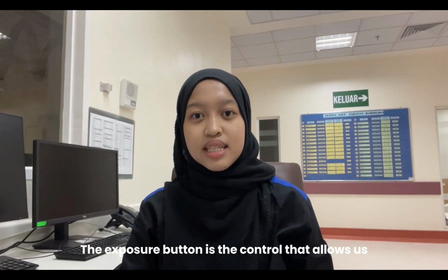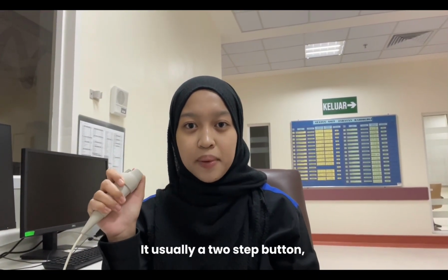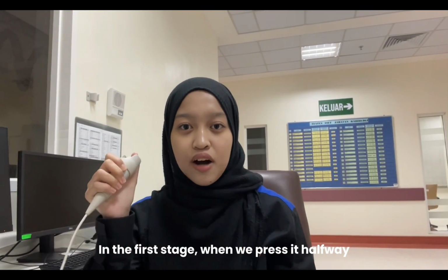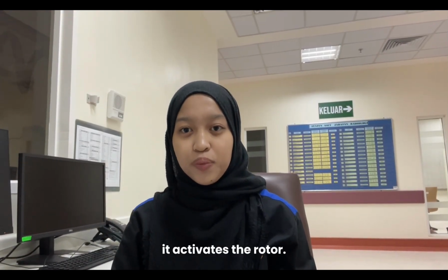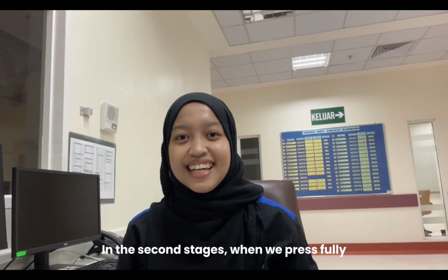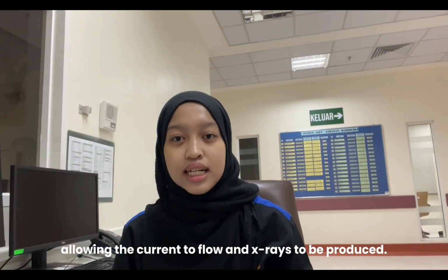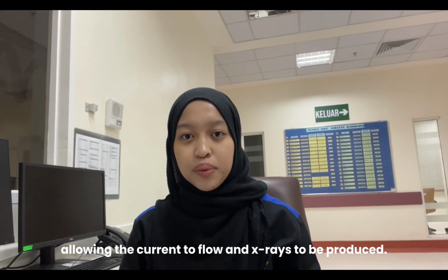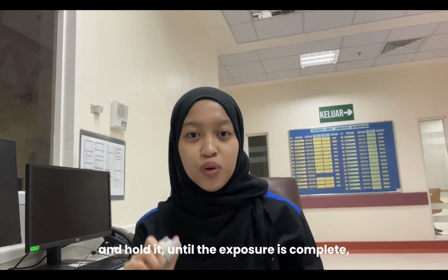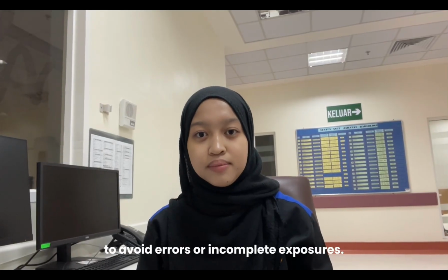The exposure button is the control that allows us to set the X-ray exposure. It is usually a two-step button, meaning it has two stages when pressed. In the first stage, when we press halfway, it activates the rotor. This starts the anode rotation and begins heating the filament. In the second stage, when we press fully, it actually starts the X-ray exposure, allowing the current to flow and X-ray to be produced. It's important to press the button in one smooth motion and hold it until the exposure is complete to avoid errors or incomplete exposures.